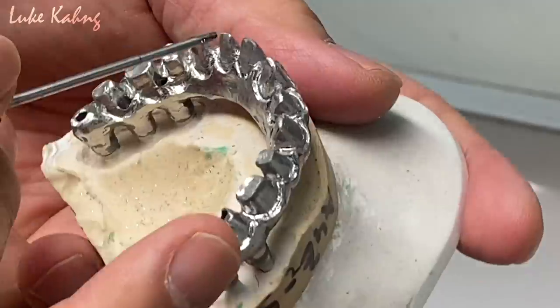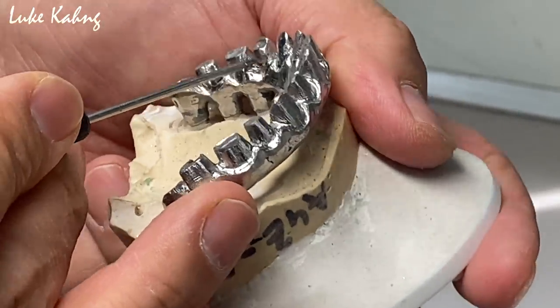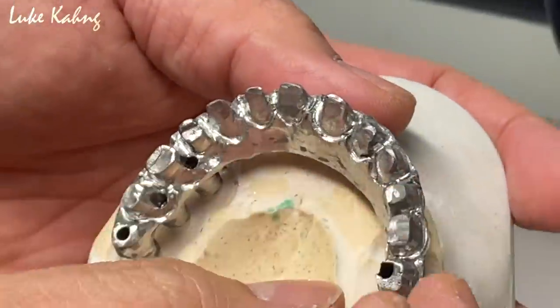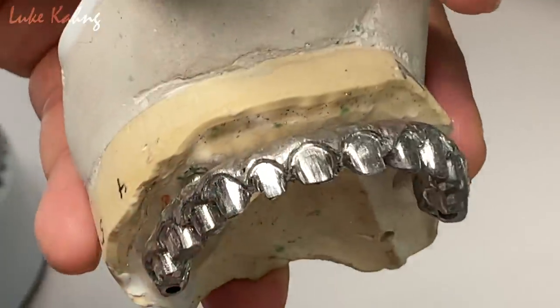Yeah. Then this is fine. Just a little bit. This is okay. Probably three units. We're going to make 3 units. And then singles for the anteriors. All right. Okay. Yep. That's a good idea.